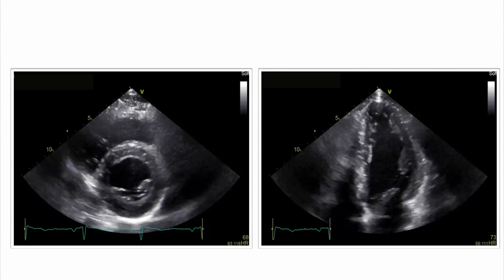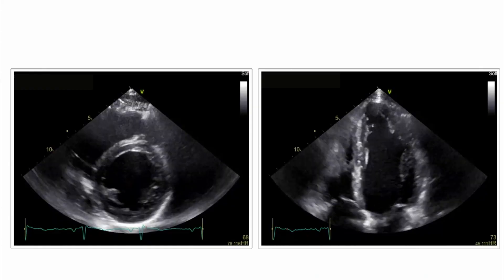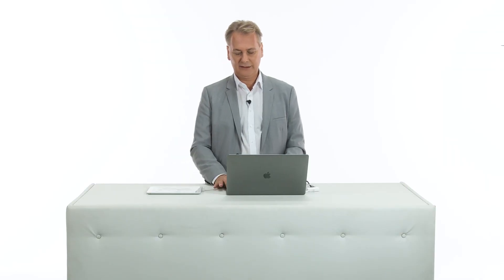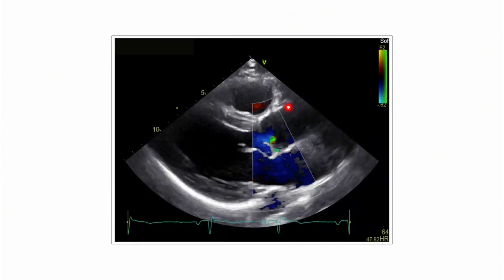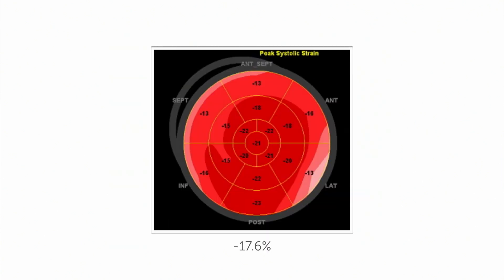Would you prefer surgery or recommend surgery in this individual? He has severe aortic regurgitation. Let's look at the ventricle — radial function looks quite okay and if you calculate ejection fraction it's quite normal too. Here is the aortic regurgitation. You see it's a very eccentric jet where you would probably underestimate the severity of aortic regurgitation. The strain is minus 17.6%, and you can see that there is already some form of deterioration of strain here at the base.